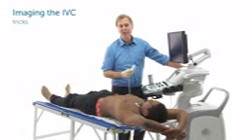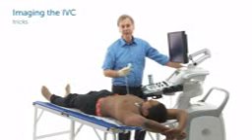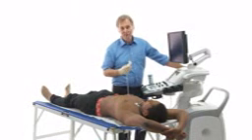In the lectures on imaging, we already showed you how to image the inferior vena cava from a subcostal view. I would like to review this and add a few more tricks, because we will need to image the inferior vena cava if you want to assess fluid status and pressure of the right atrium.